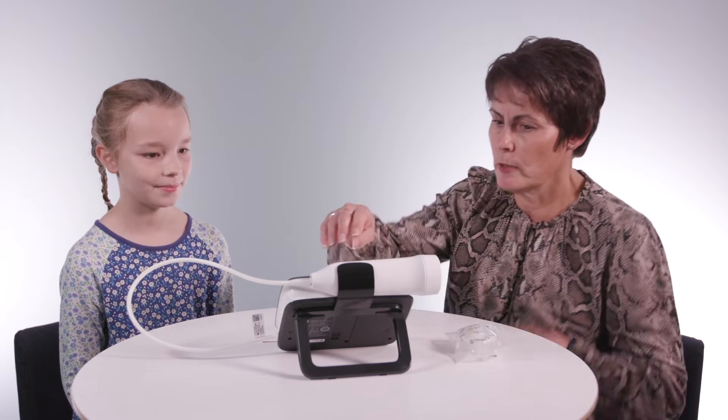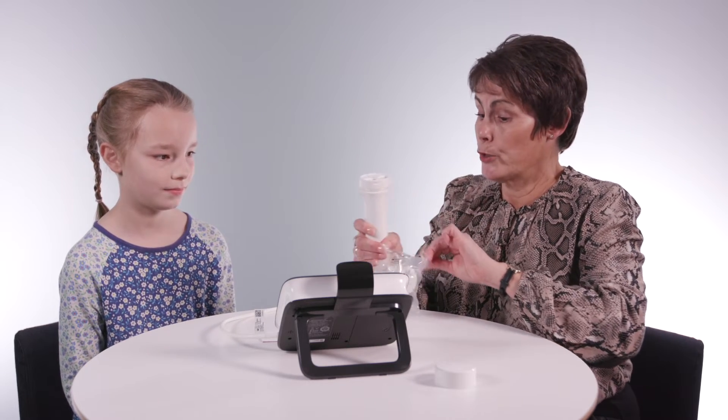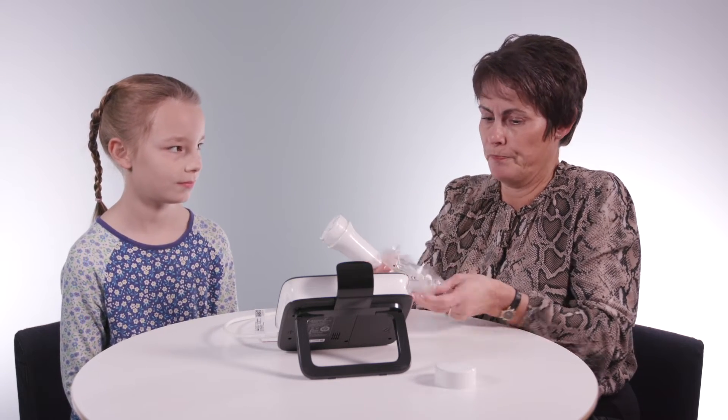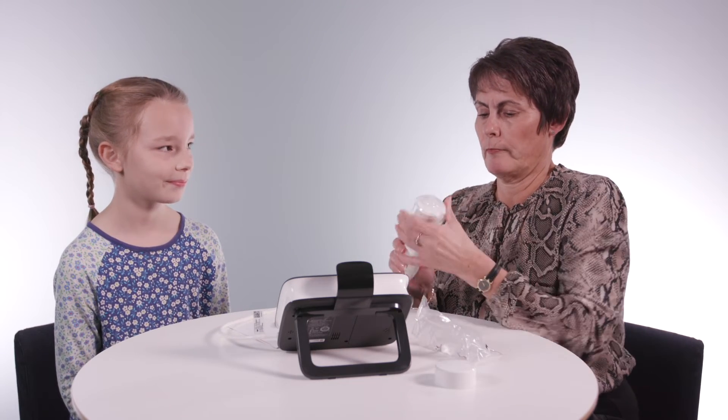So there are three parts to the test that we're going to do. I'm going to take this off here and take that plastic cap off. This is a brand new mouthpiece now for you, and we're going to pop that on the top.